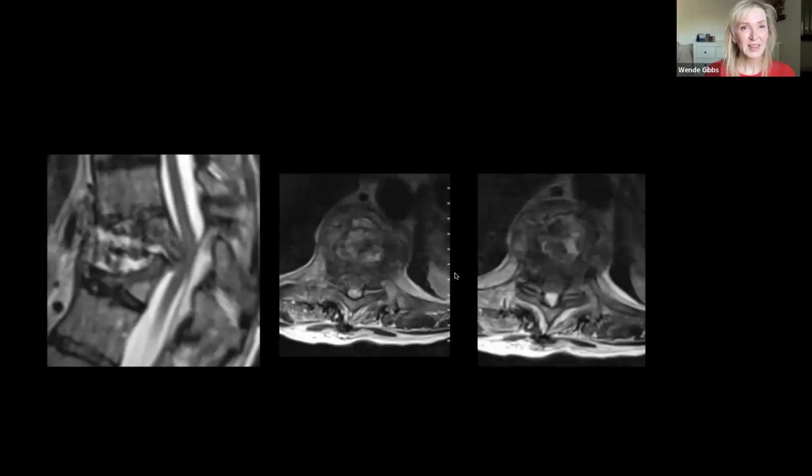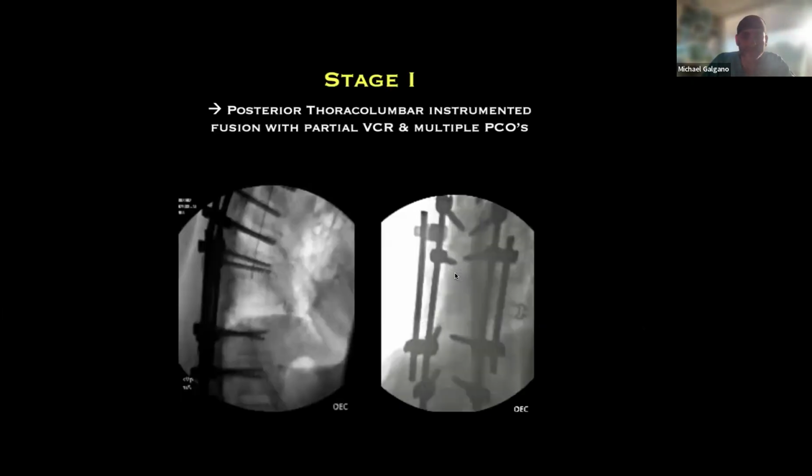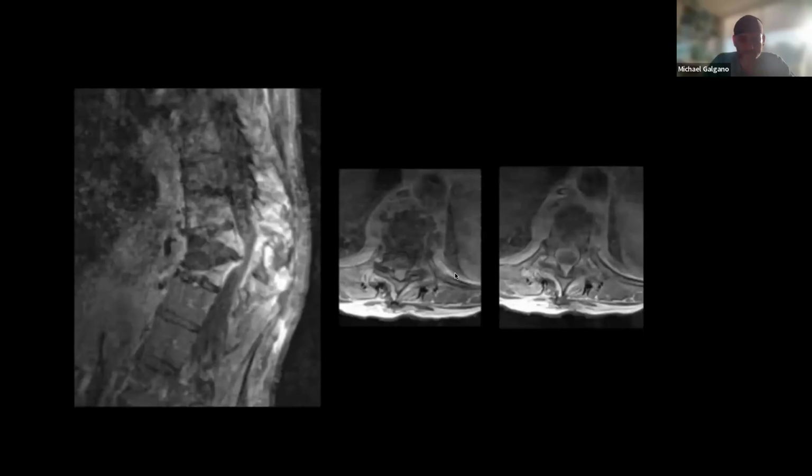Yeah, and it looks similar, right, with that kind of fluid signal and kind of dead tissue in there. It looks the same, awful, right? It does. A completely different case, but similar. So I just wanted to go over a complication we had in this case.